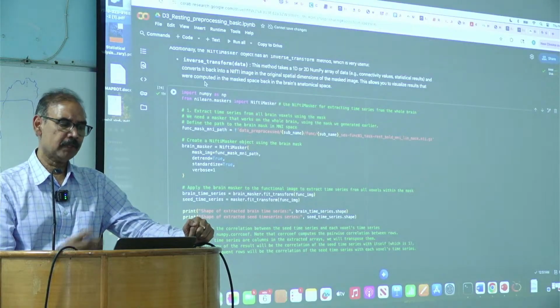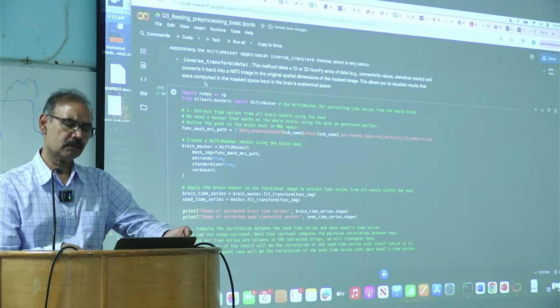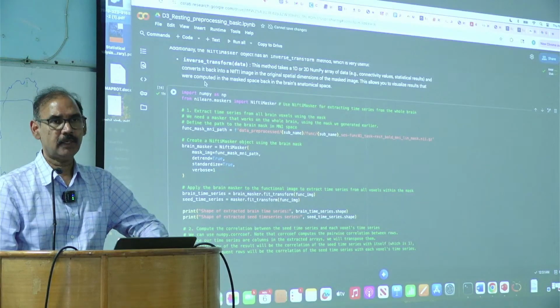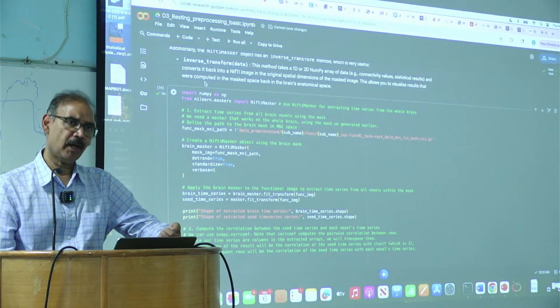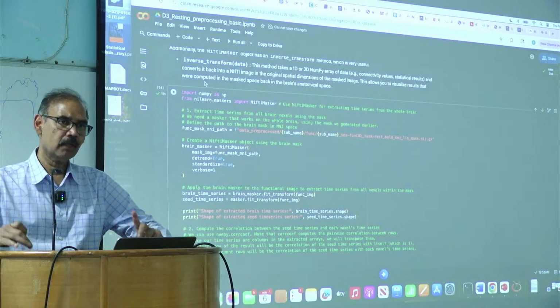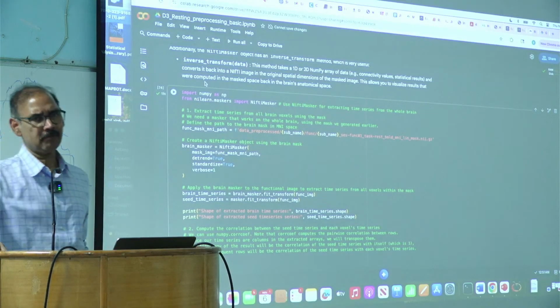For resting state, everything is at baseline, so other networks are not going to get affected because you are stimulating one, right? Everything is present and we can map everything at the same time. But for task, we would typically have to focus on one network at a time. And that's one. Second thing is you cannot always assume that the other networks will not be affected.